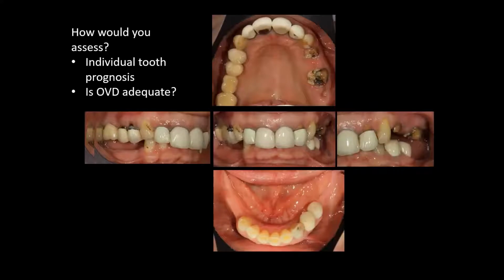Okay, let's think. The minimal height beneath the abutment. How much is the minimum height beneath the abutment, and that actually cemented the crown? You know you have a direct screw channel to the crown. How thick is that abutment? It's about a millimeter or two. That can be right. So the longer the better. Well, put it this way: you need between 5.5 to 6 millimeters to restore. That's minimal, because you can do it. Now the issue is that that's not enough in terms of what the patient would want. So we need to determine, for this patient, how much to open the occlusal vertical dimension.